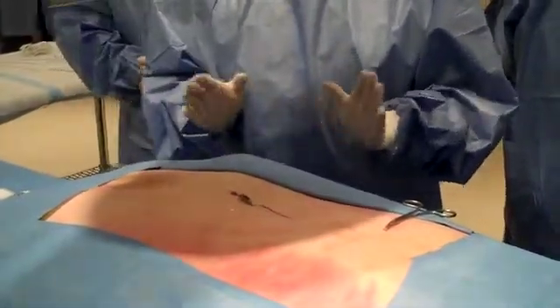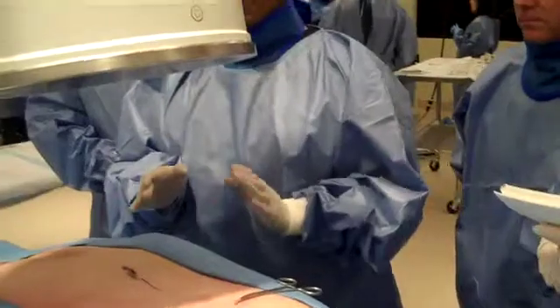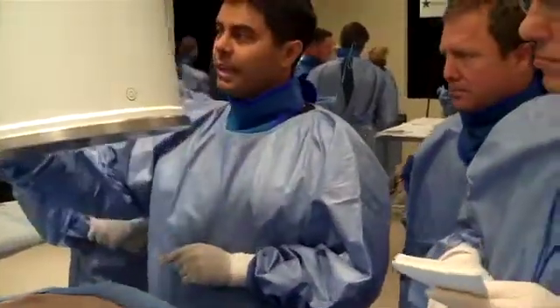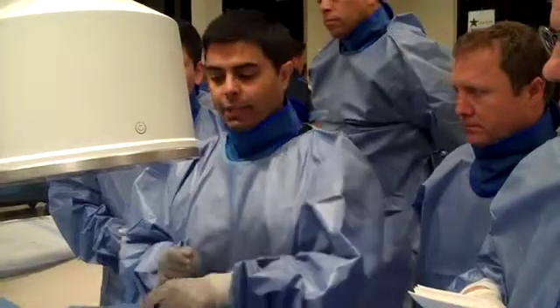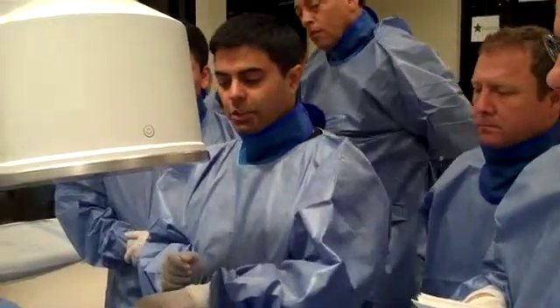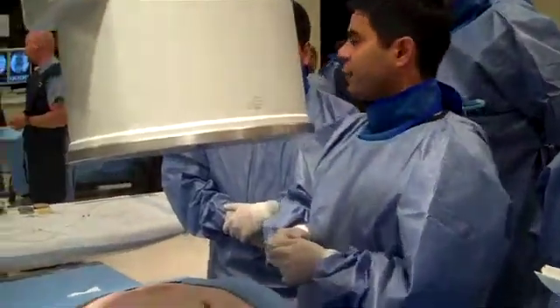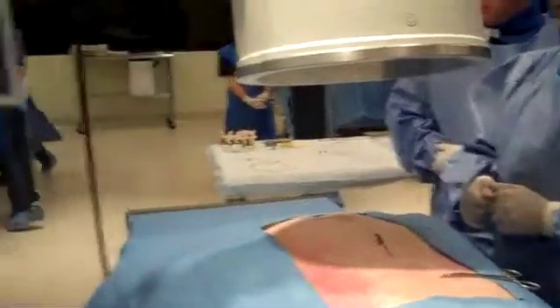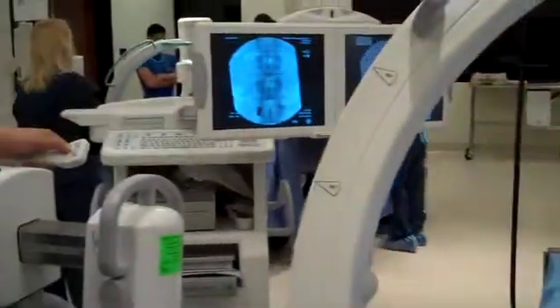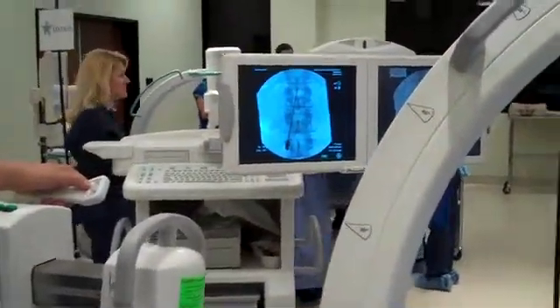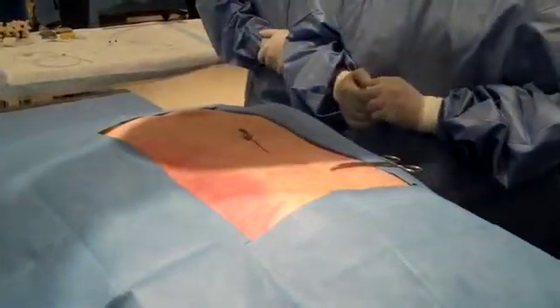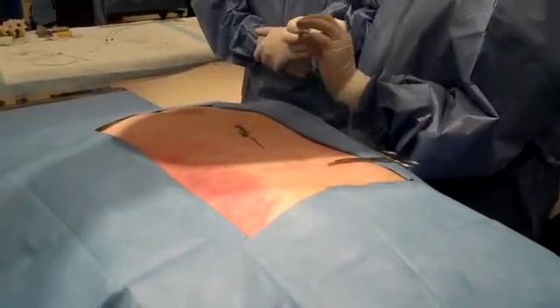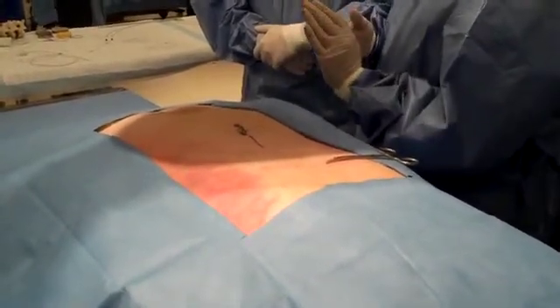Now the other thing that I do — and this is a very subtle motion — is that depending on where my tip is with respect to the midline, I actually adjust the bevel of my needle to accommodate more. If you'll notice over here, I just slightly passed over the midline. So what I'm going to do — since I passed it over to the right — is adjust my bevel to the left, so that when my lead comes through, I'll stay towards that left side.